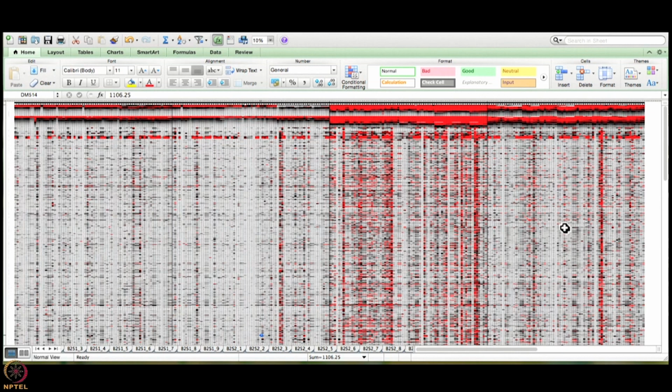When you minimize this Excel a little bit and you apply this color gradient, what you can see is that the signal intensities, in fact for this whole batch, but batch 2 set 1 is really high compared to the rest of the batches. You will know that mainly from the IgG signals here. This particular line which you see here is all your IgG mix, and this particular line is your anti-human IgG.